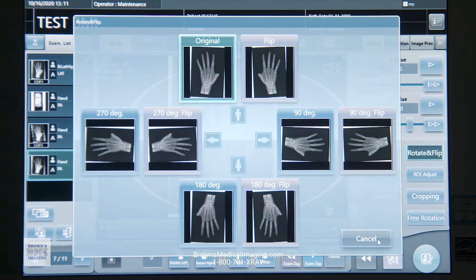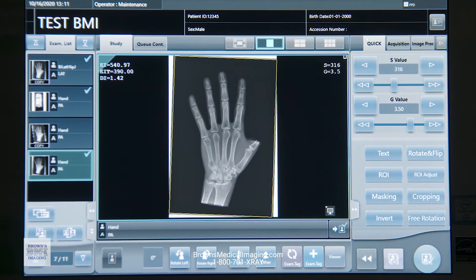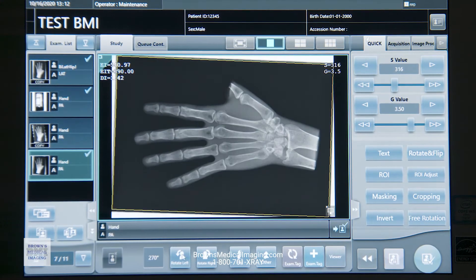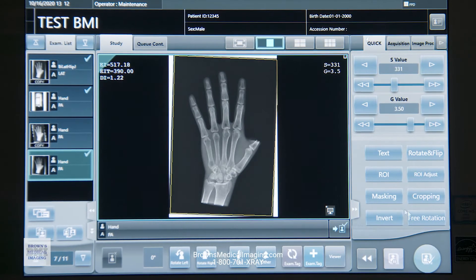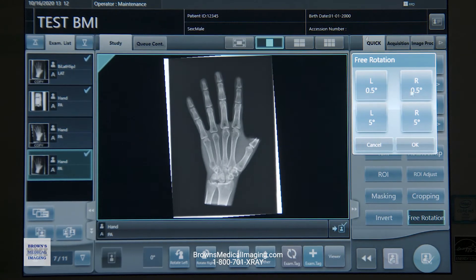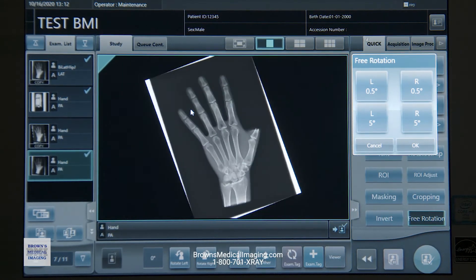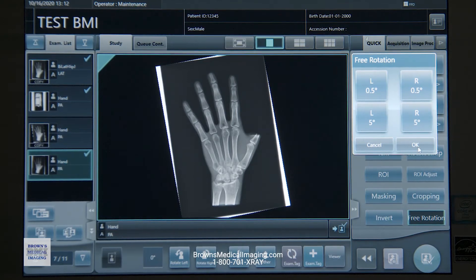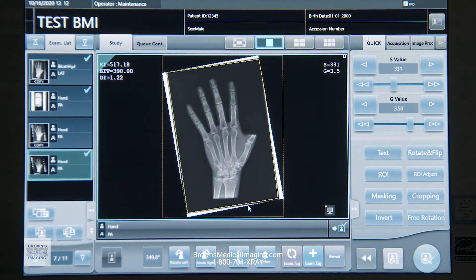Next tool is rotate and flip — you can use that for a quick view of every option. You've also got rotate and flip down at the bottom of your screen: rotate left 90 degrees, right 90 degrees, or a horizontal flip. With the new version of the software, we also have free rotation. Over here towards the bottom right corner, we've got free rotation — we can use those little increment tools, or I can just grab the image and drag it around. Whatever angle I want — I hit okay and that's the way it's going to send. It will shrink that image to fit into a 17-inch box.